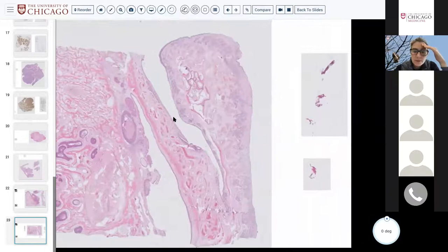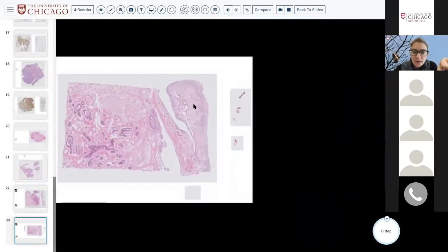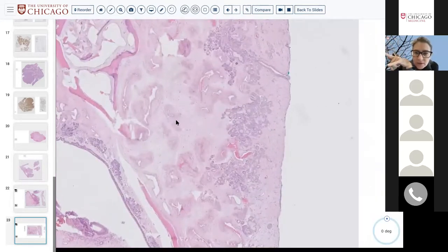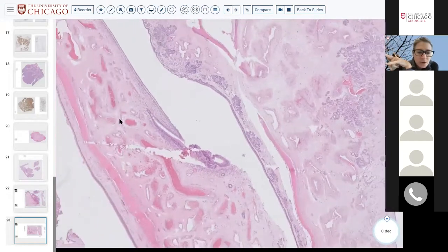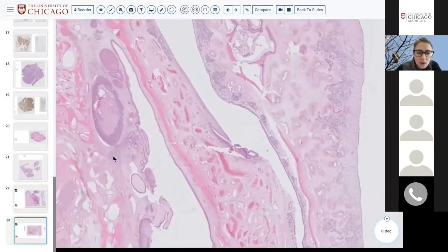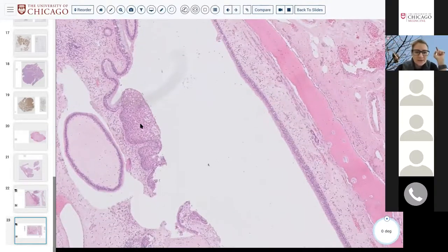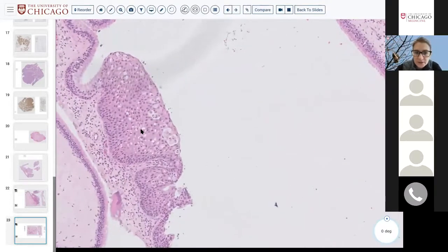So here is how it works, right? Excuse me, the septum is not in this picture. Here is the turbinate, right? That's coming off of the lateral nasal wall. Here's the turbinate with all its muscular vessels. And then you go to the lateral nasal wall. And here, right, on the epithelium lining the lateral nasal wall is where you see this early little papilloma with neutrophilic microabscesses.